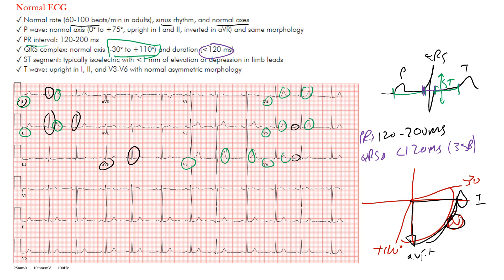V3 through V6 — here's V3 with upright T waves, V5 and V6 — and they have what we call a normal asymmetric morphology. Keep in mind they have that slow upstroke and more of a steeper downslope. So again, just to recap: this is a normal ECG, there are no abnormal findings that are significant or alarming here.